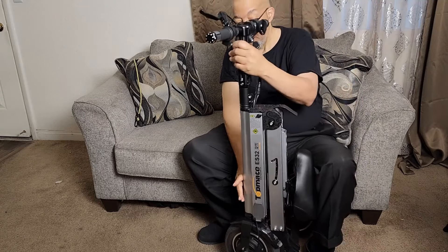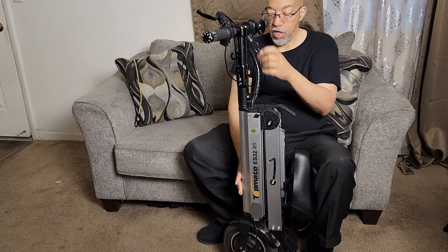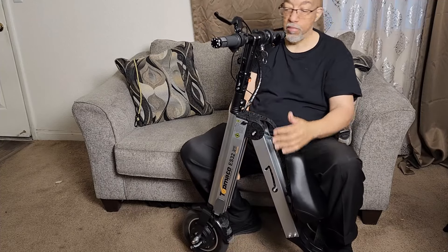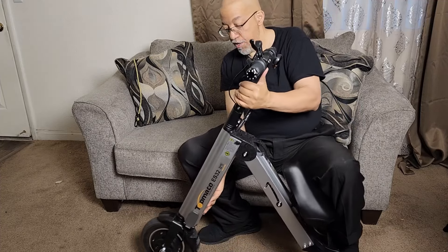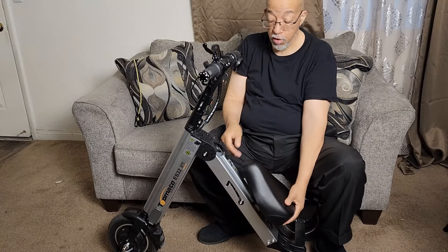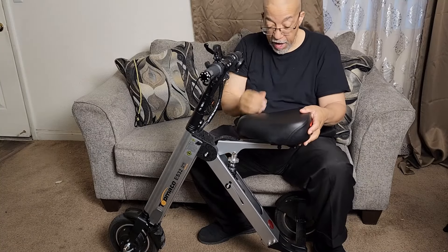This is an electric scooter and it does come with a key. It unfolds very quickly. I do ride this on the bus, and yes, here in Las Vegas, Nevada, you can put these on the bus as long as you can fold it up, and I can fold it up.